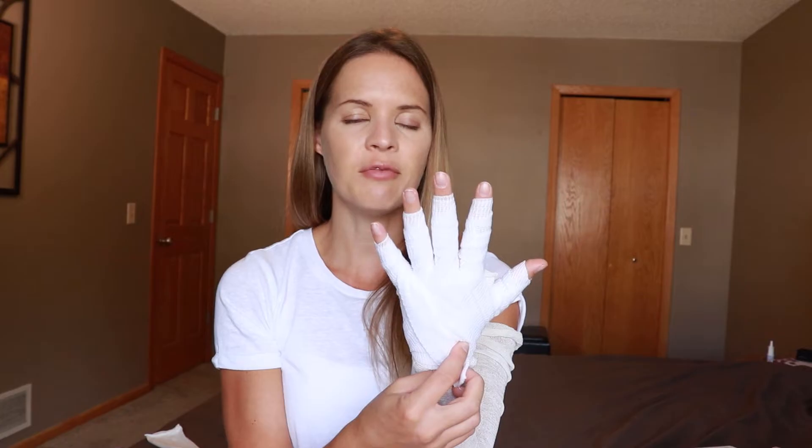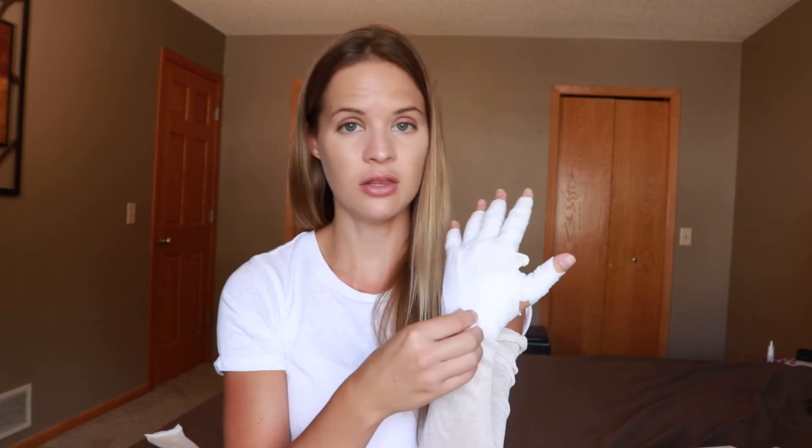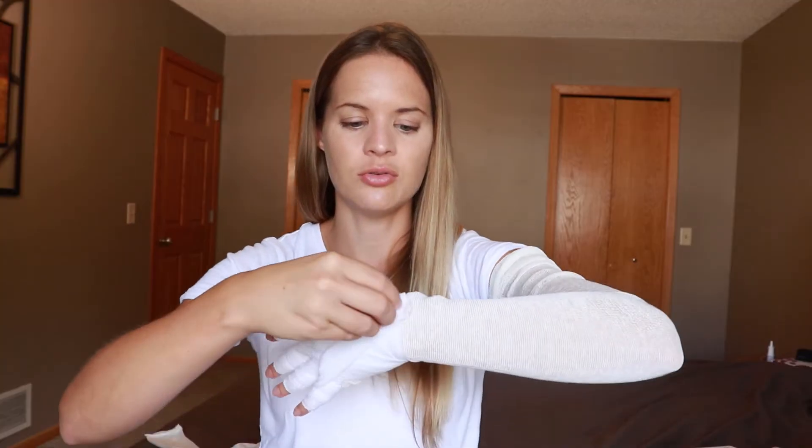Anything left you can just tuck into the back. For a lot of people, you may need a second roll — some can only use one roll for three fingers and then need another roll for the other two. If you have extra at the end, just trim it off, tape it down, or tuck it into the other piece.